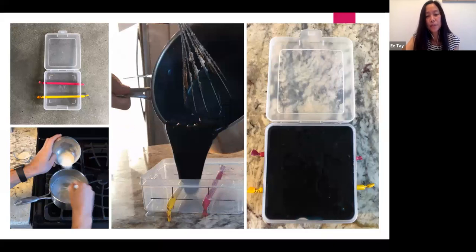And so what this particular guy did was he took long balloons, the kind you make balloon animals out of, inflated them and tied them on each side, and inserted them through Tupperware. He mixed the recipe with the Metamucil and the jello ingredients, and then poured it over what he would call the vasculature, such as the animal balloons. And then you'll see here, once it hardens, it actually looks like the one picture on the right side.